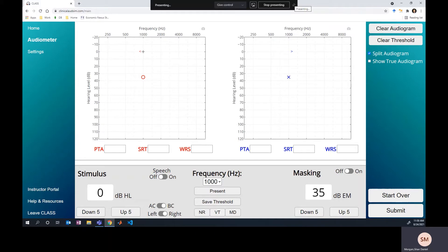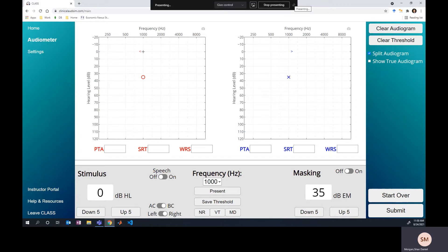All right, so with this audiogram, we have completed air conduction and bone conduction testing in the left and the right ear, and the next step for us to do is we see this big air bone gap between the bone conduction and the air conduction thresholds in both ears, so we've got a couple of questions here.